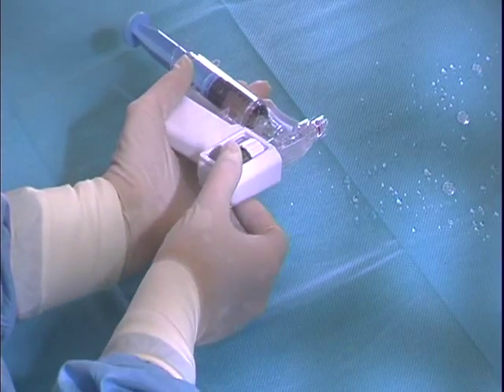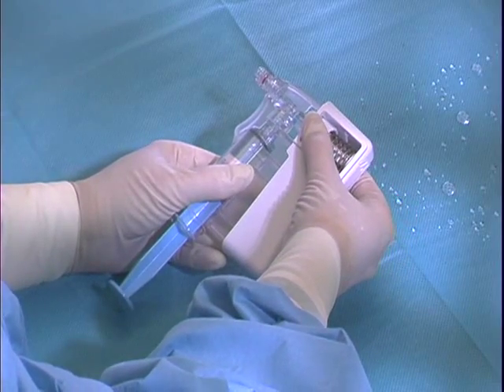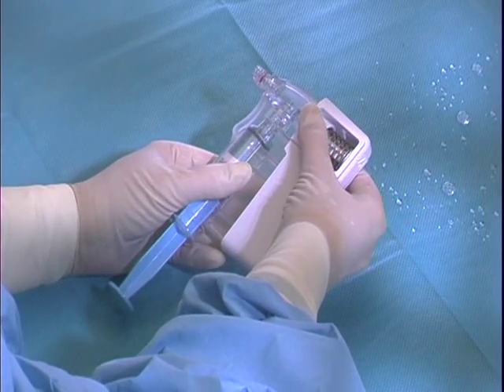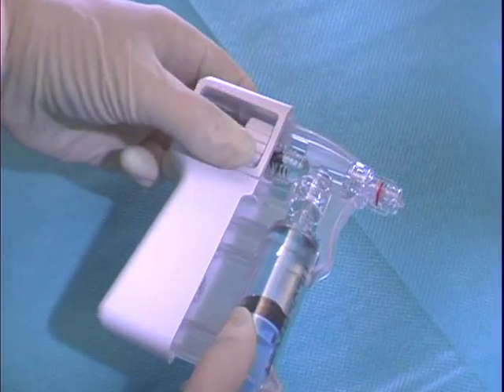The amount of fluid to be dispensed is set using the thumb wheel on the Squirt. Volumes can be set from 0.1 ml to 1 ml.